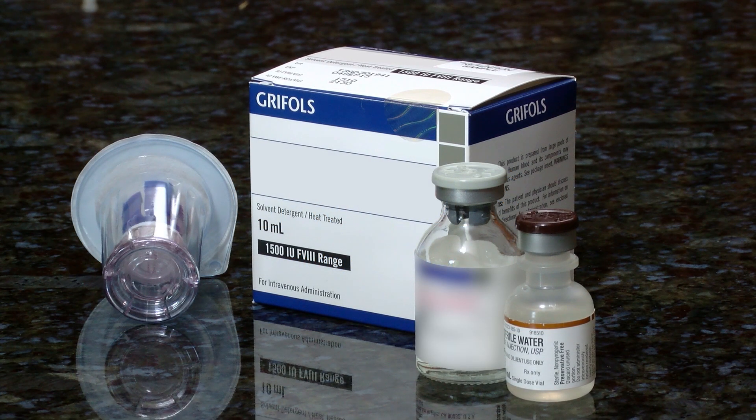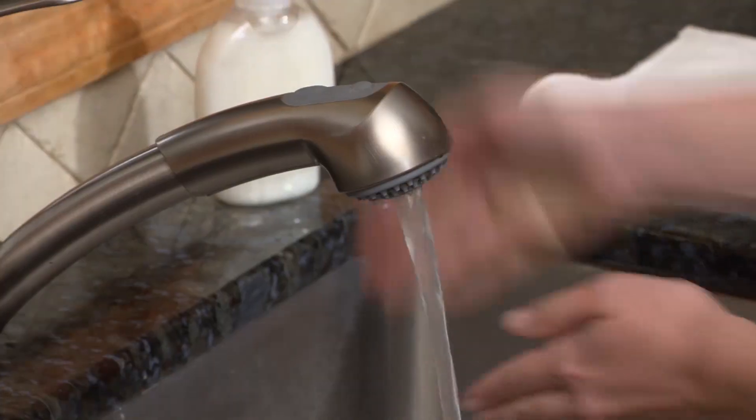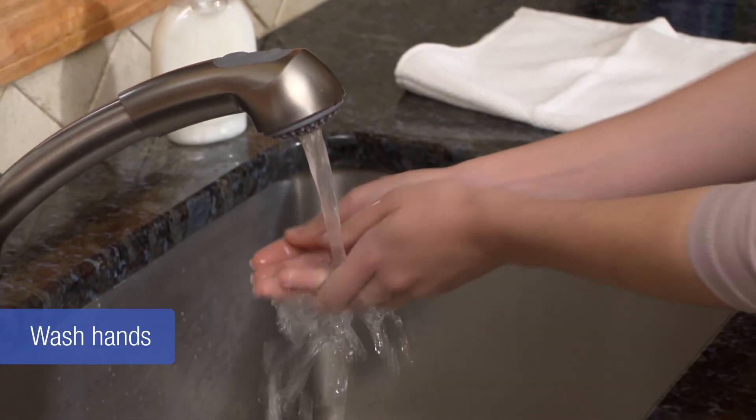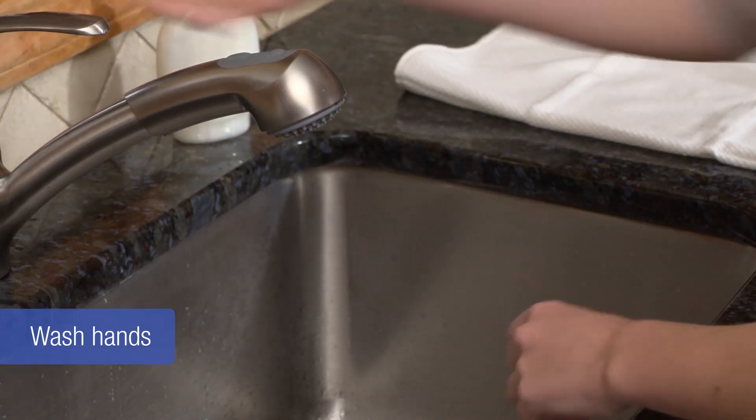How to reconstitute and mix your factor. Start by washing your hands with soap and water and make sure the vials of product and sterile water are at room temperature.